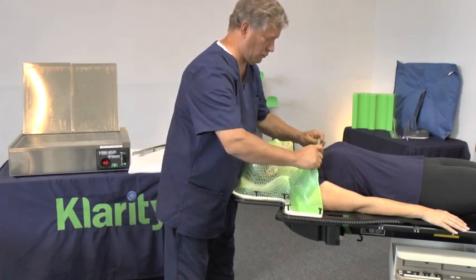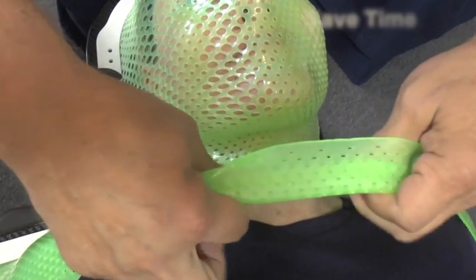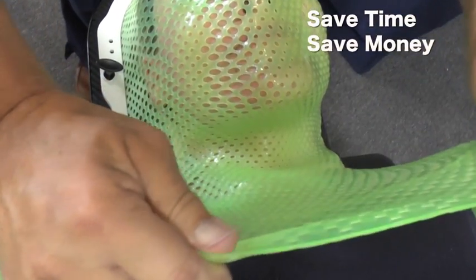Now watch carefully. A therapist can easily remove any wrinkles or overlaps from the Clarity Green mask. You'll save time and money by not having to throw away a Clarity Green mask if it folds onto itself.